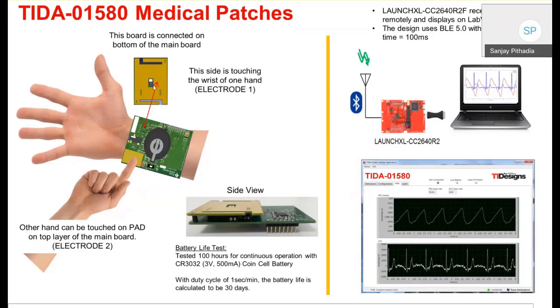And then if you put your finger or the wrist below this particular window, which is for the photodiode and LED, you can actually get PPG data. On the right side, what I'm showing is the receive side, where we have a LaunchPad from CC2640R2F. It's an EVM. It is receiving all the data which was sent by this design, and it is showing the data on a GUI. The GUI is also available for you to download, and it is available in LabVIEW.